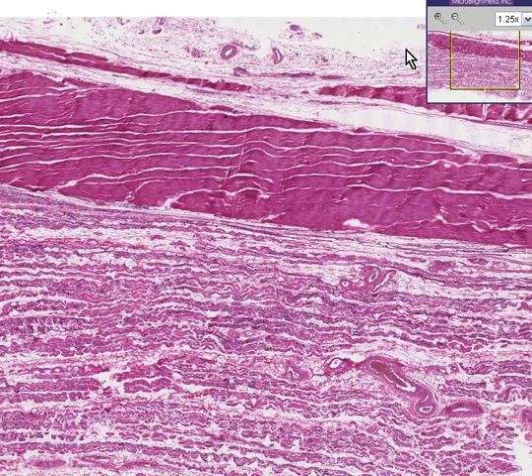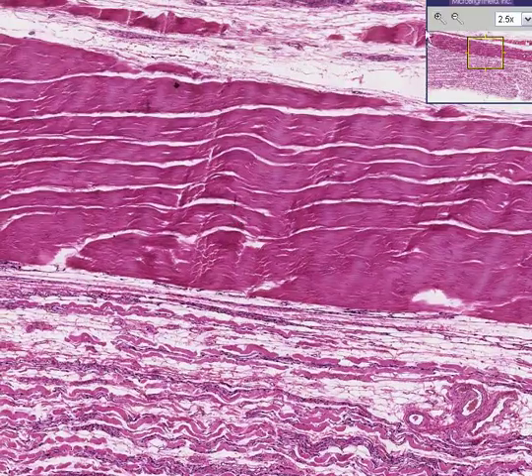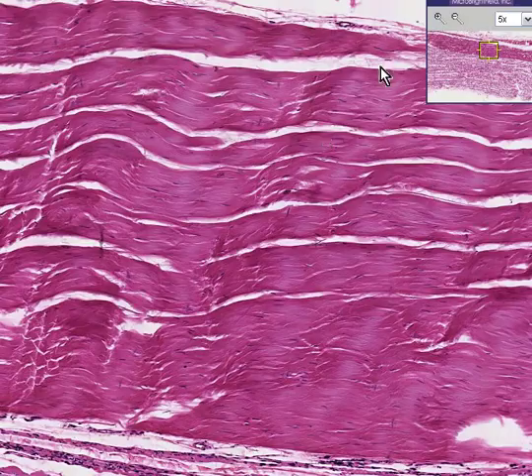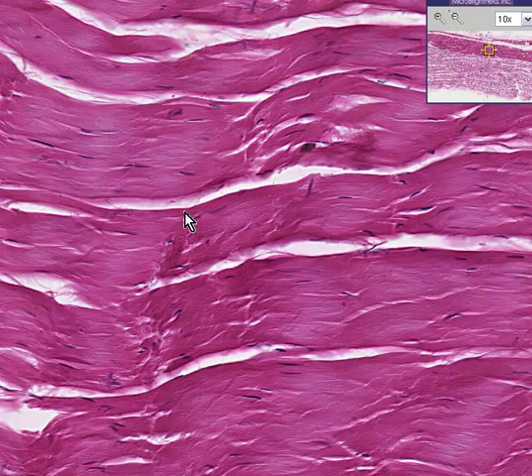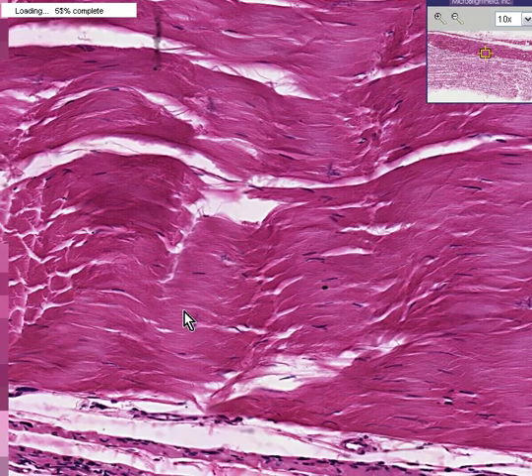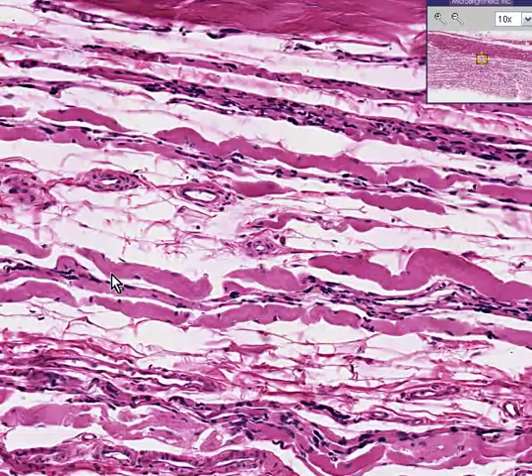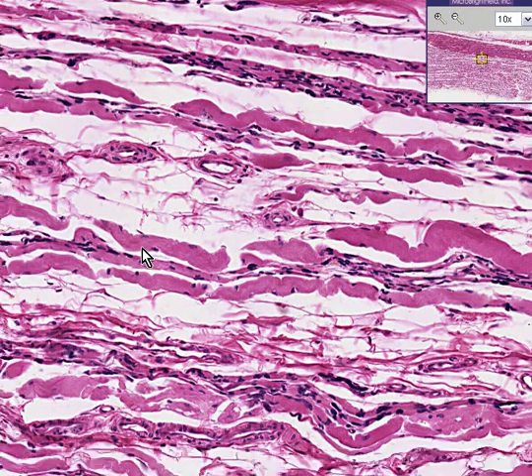A skeletal muscle fiber cannot live unless it's innervated. Notice that in the top we still have some fibers, though the striations are not really normal. Now in the bottom we're looking at skeletal muscle fibers that are no longer straight — they're a little bit wrinkly and thinner than they should be.